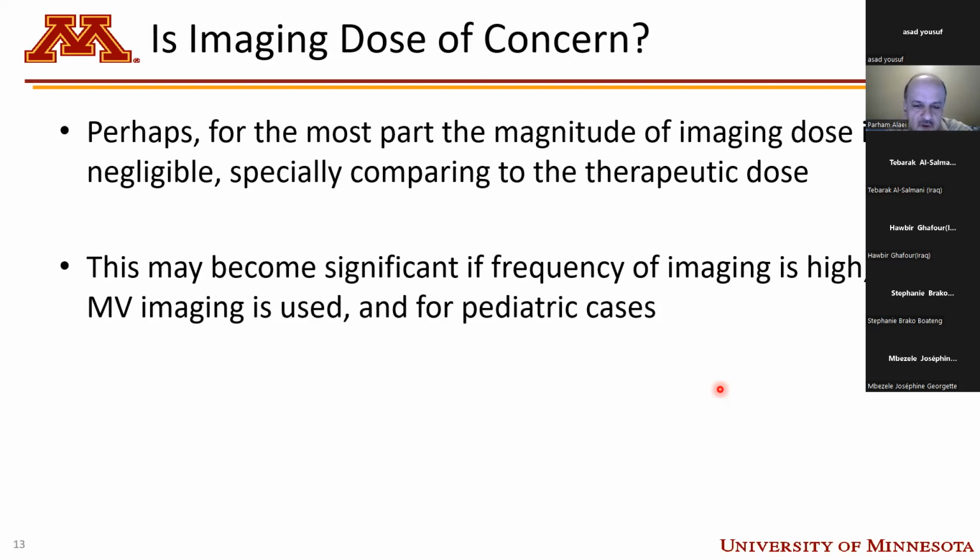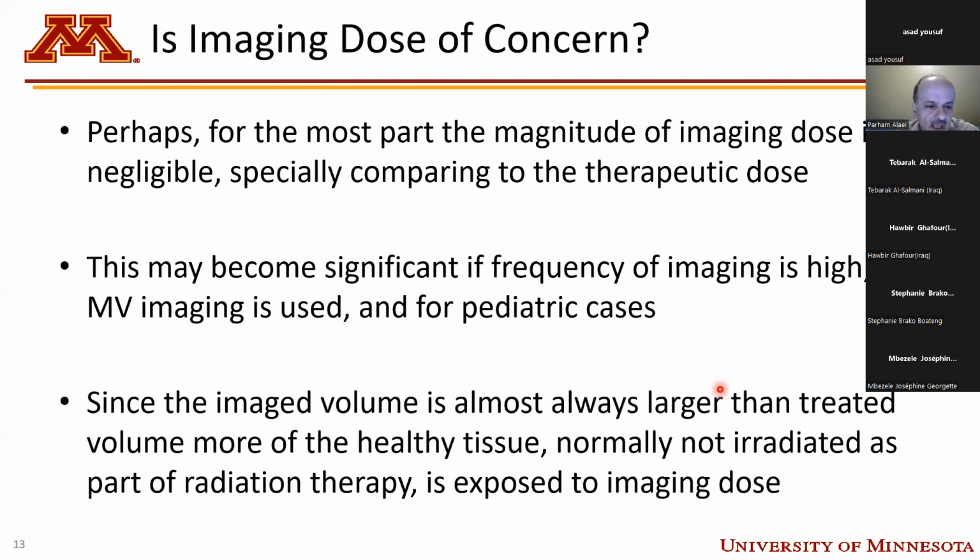And there's a special concern for pediatric patients, because as you know, they're going to live a long life, and the concern here is for the long-term carcinogenic effects. So there has been more focus on limiting the imaging dose for pediatric cases.